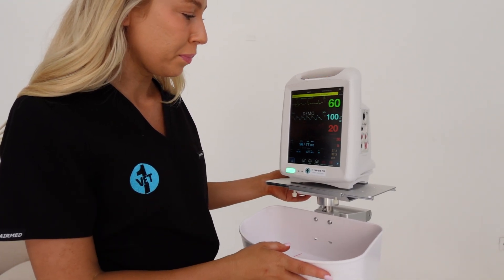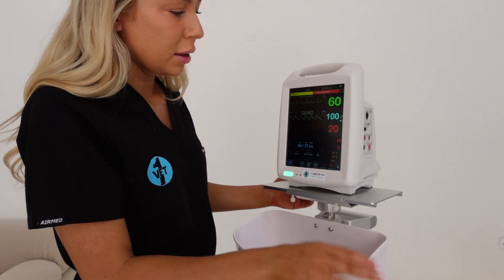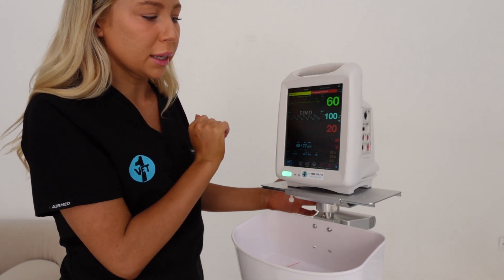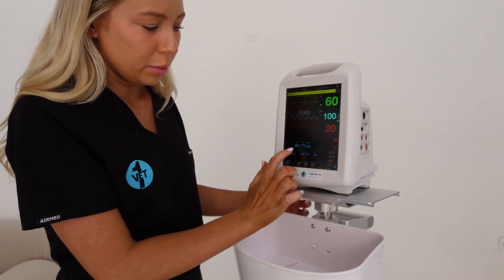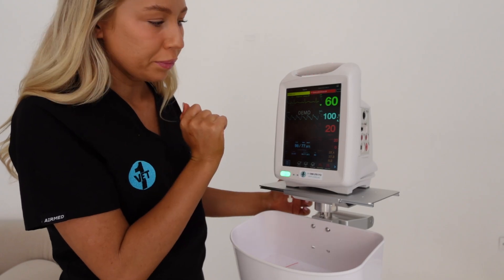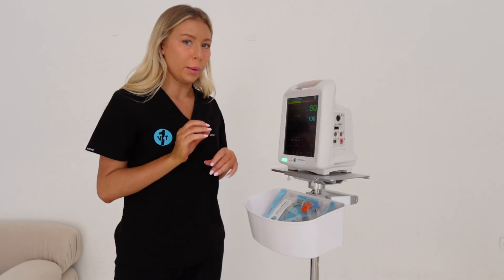Looking at the monitor here, we've got heart rate up here - these are all normal parameters. Heart rate is sitting at 60, SpO2 is 100, respiratory rate is 20, blood pressure looks nice, and down here we've got our temperature.